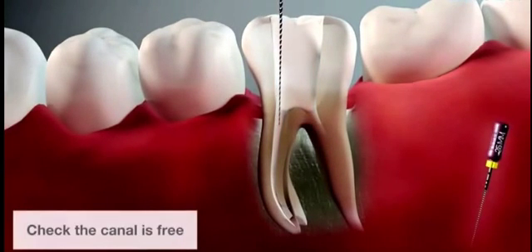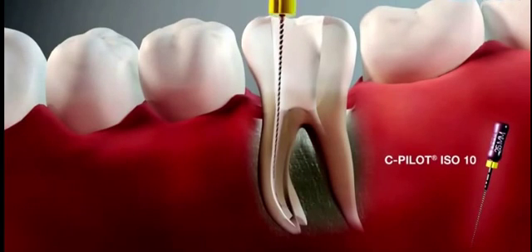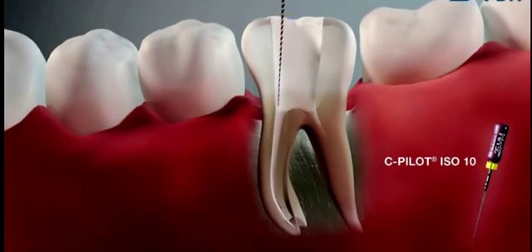Now check that the canal is free with the help of a C-Pilot file size ISO 10. Continue in this manner until approximately two-thirds of the canal length has been reached.